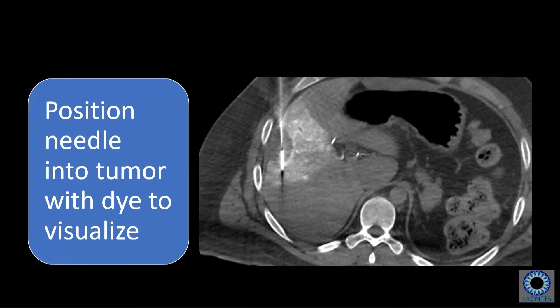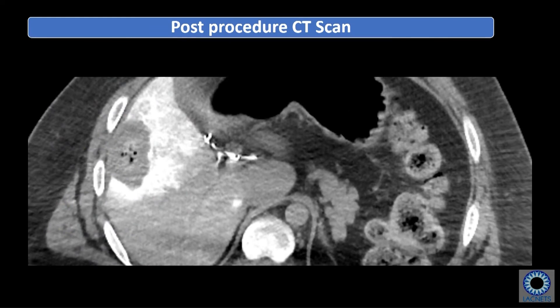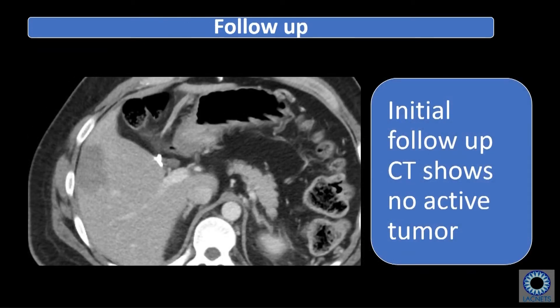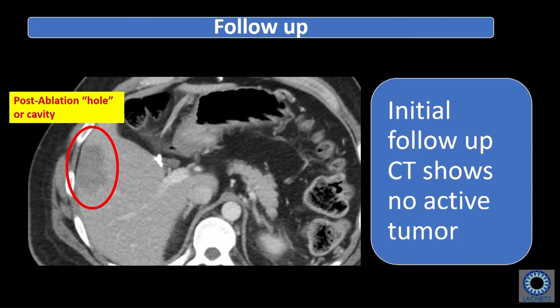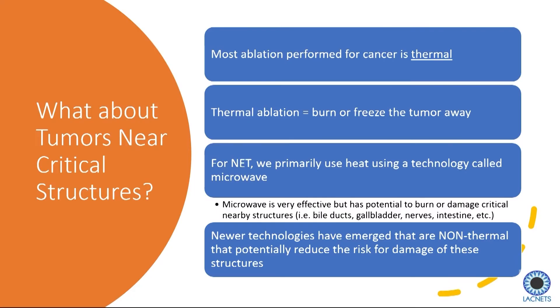Also notice that when we originally saw the CT scan, how small that lesion appeared. But when we inject the dye directly into the tumor, we can see it's actually much larger. So not only are we able to precisely position the needle, we can ensure we're getting a complete treatment — because this lesion was actually bigger than we initially thought. After ablation, you can see little black dots inside, which is gas from burning the tumor, meaning the tumor is now completely dead. On the follow-up scan, there's no active tumor — consistent with dead tissue. We call this the post-ablation cavity.